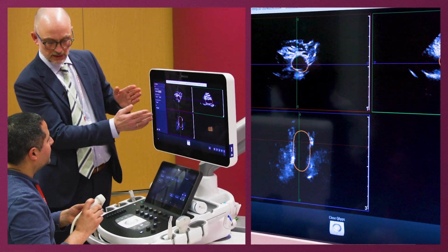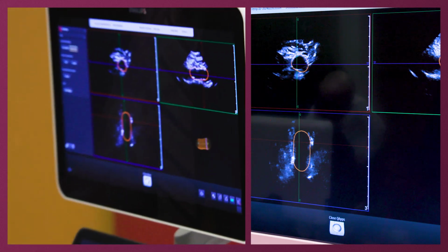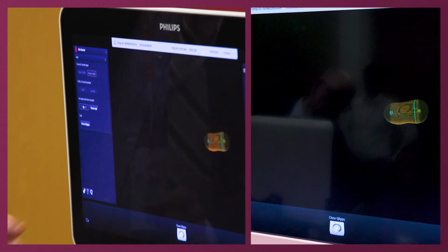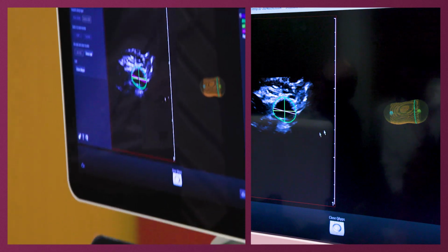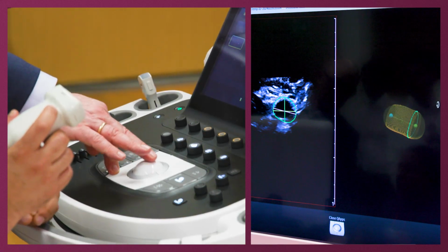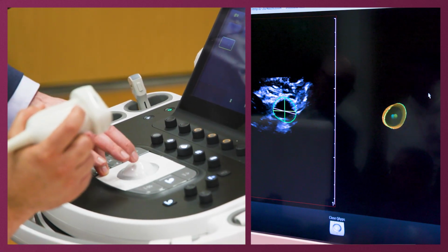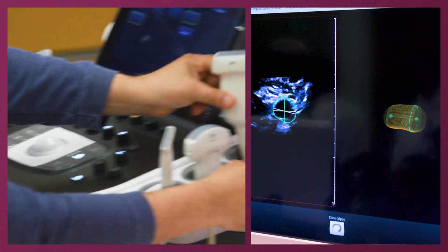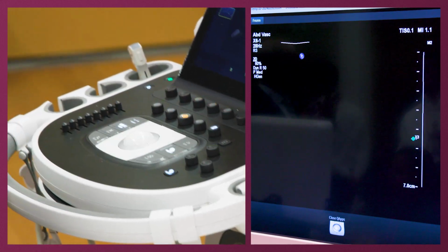There are actually possibilities to edit this. If you accept, you just say accept. And then you get the diameters here. Nice. Like before we had like 14 and now we have like 18.7. But as I mentioned, this has not been validated on patients without aneurysm. The system believes that there must be an aneurysm, so it gets confused.